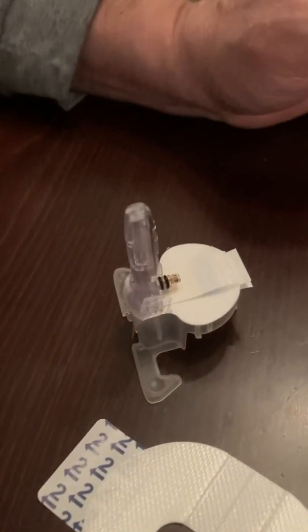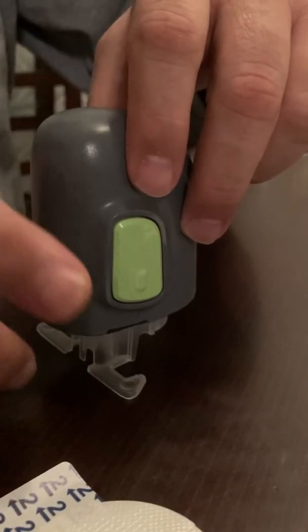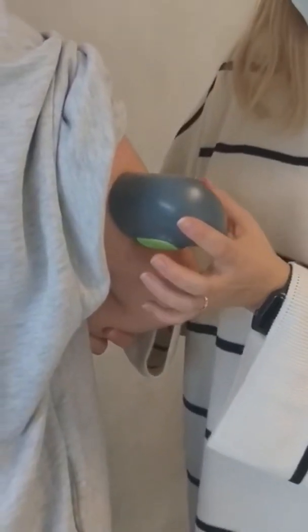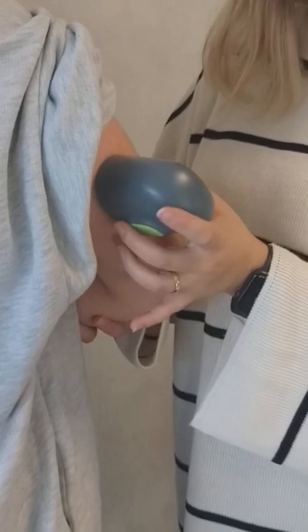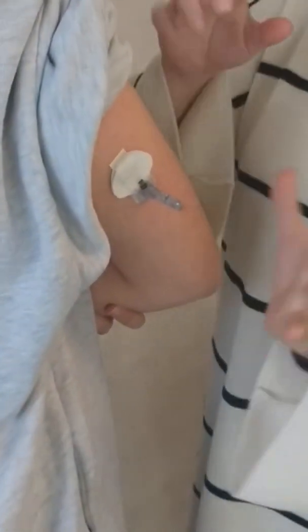Make sure that you put the sensor onto a hard and flat surface. Now take your attachment apparatus. Place the apparatus on the upper arm, press the button, and press the two green buttons at the same time. Then take the apparatus back slowly. Now we have our sensor on our body.